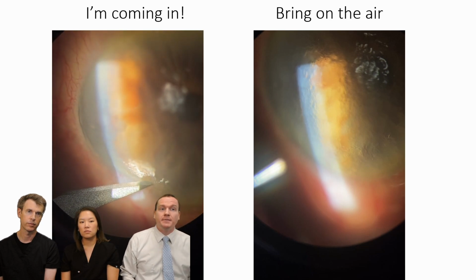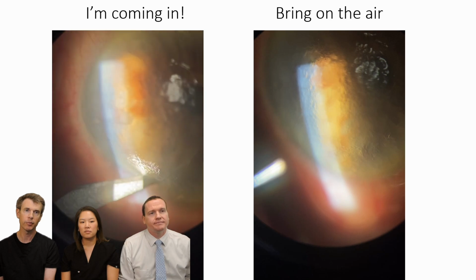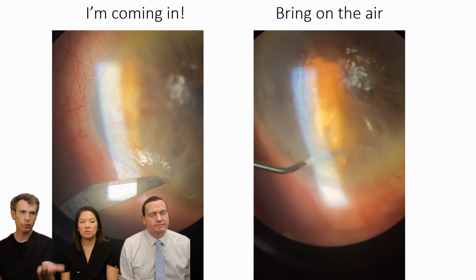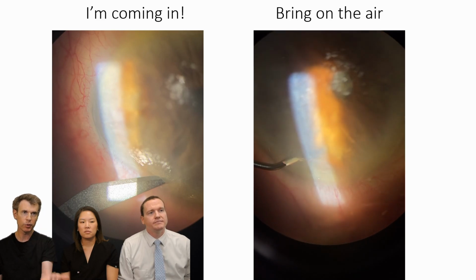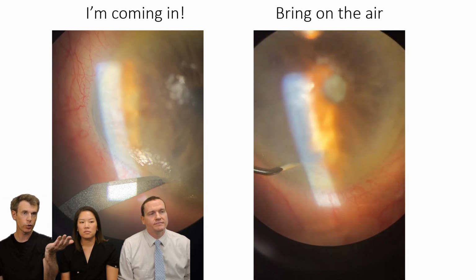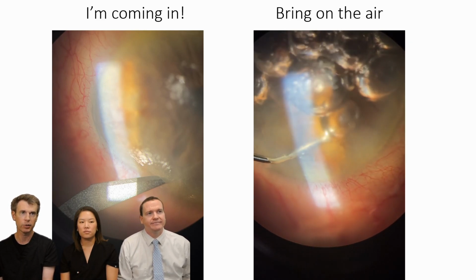Can anything be done? Yes, usually we place an air bubble at the slit lamp to try and reattach the graft. So again, there was no scroll, so I was comfortable putting an air bubble behind it, which you'll see in a moment, that actually reattaches that graft and pushes it up. And by now the graft is working, so as soon as it's in the right location, it will clear up that cornea and usually attach fairly quickly.